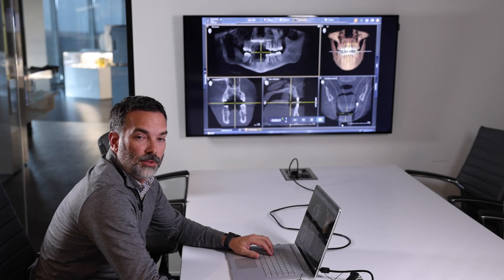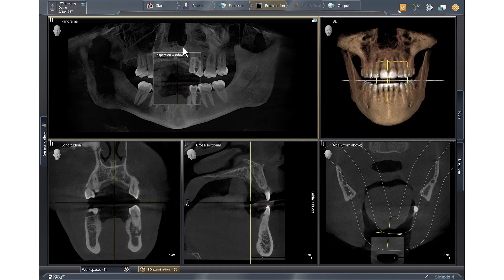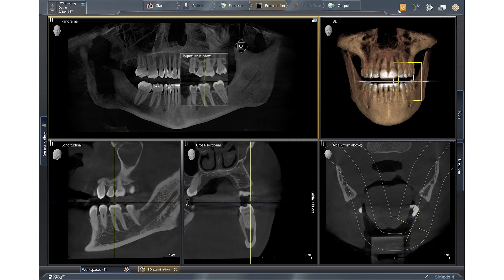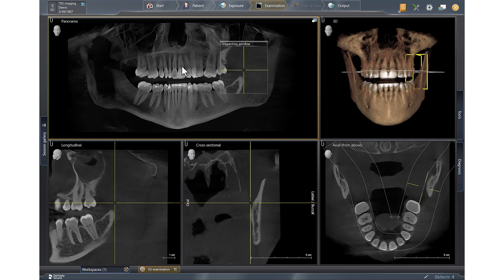Every 3D volume must be optimized to maximize treatment planning and diagnosis. As you can see, when you drag the inspection window out of the way, occasionally when your 3D volume renders it'll look a little out of sorts.